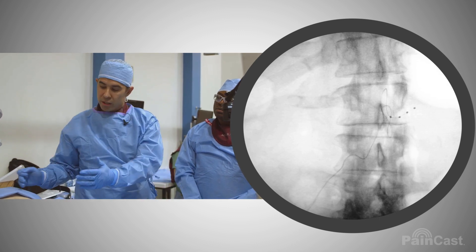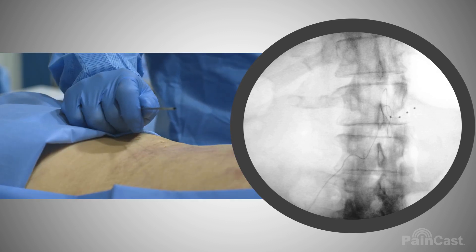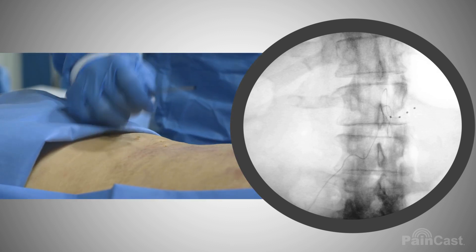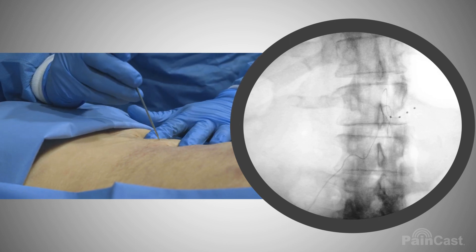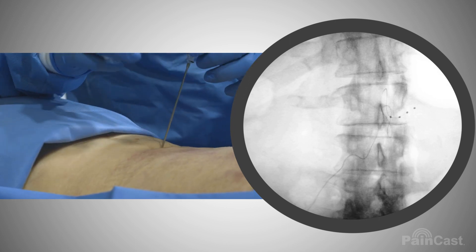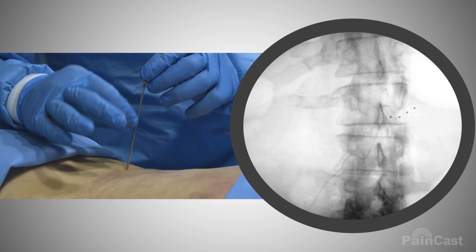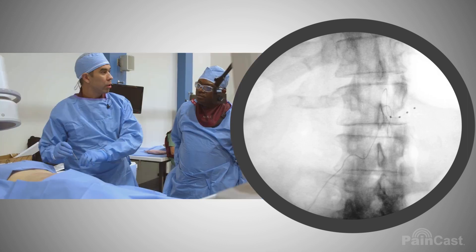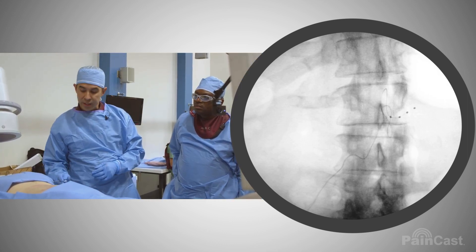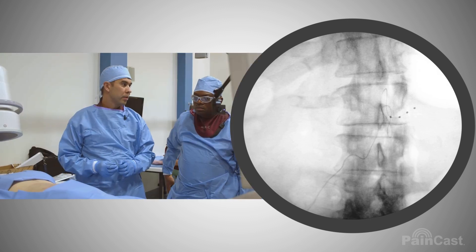Since we started making a midline incision and anchoring, that adds about 20 minutes to the case — it's annoying. But because the distance is too far, it's necessary. You could actually leave the needle in and make a stab incision, so it's not too close to the skin itself, because otherwise the lead can push up from the skin. But for the lower lumbar with the S loop, it's beautiful.